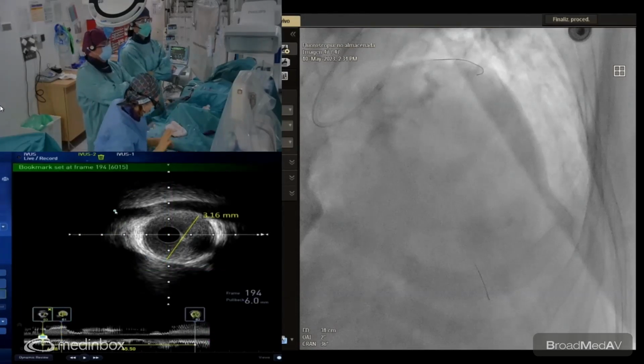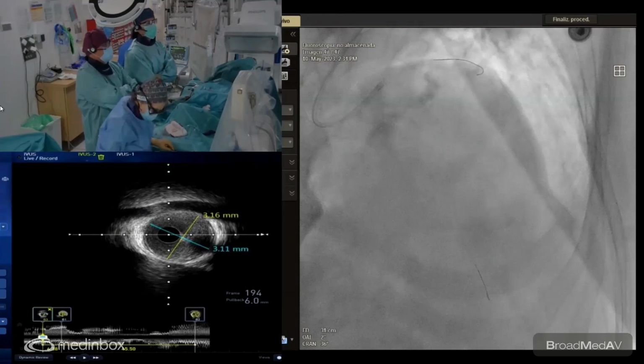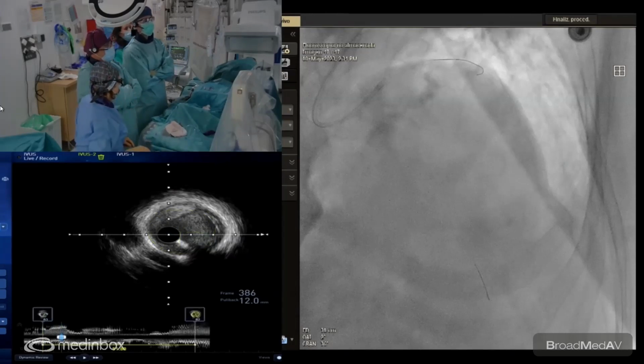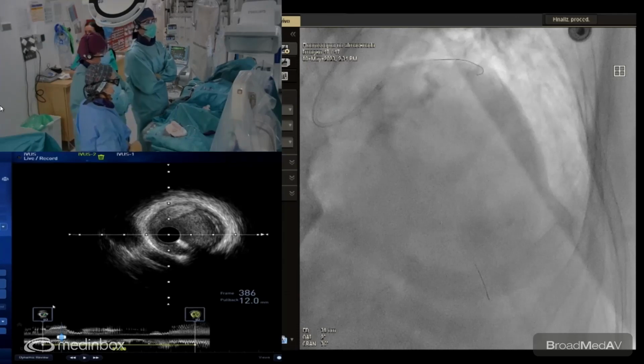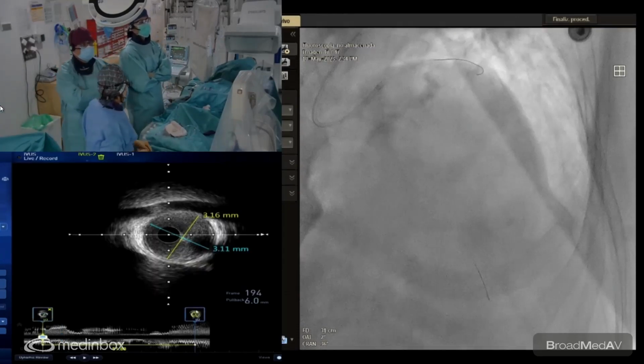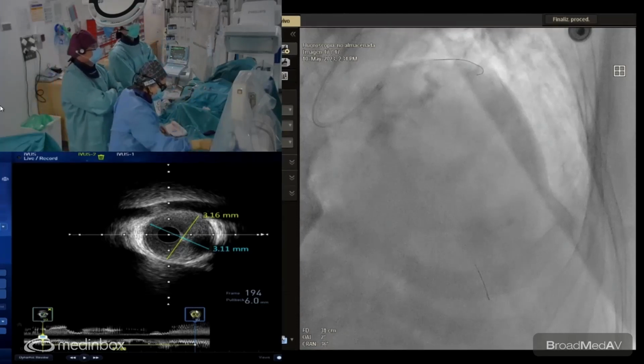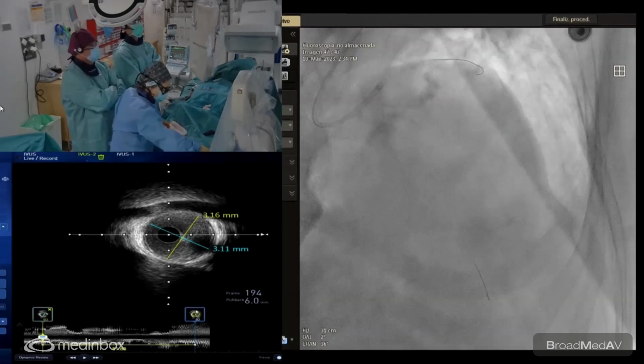Yeah, it's 3 more or less. My only doubt is if we can cover all the lesion with a 48 stent, probably not, with this measurement of 52 millimeters. So the question is whether to use 2 overlapped stents, or only 1 of 60. These are tapered stents.